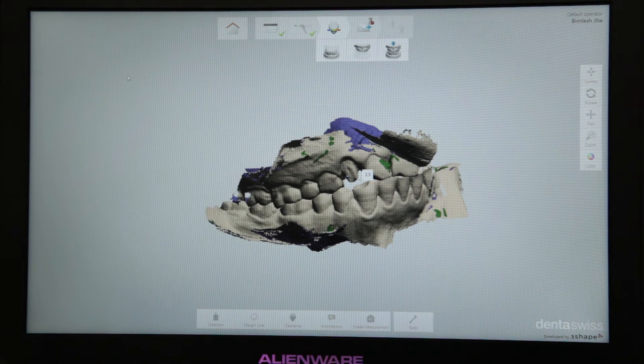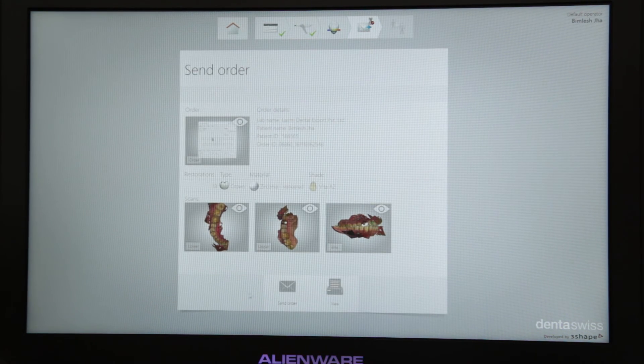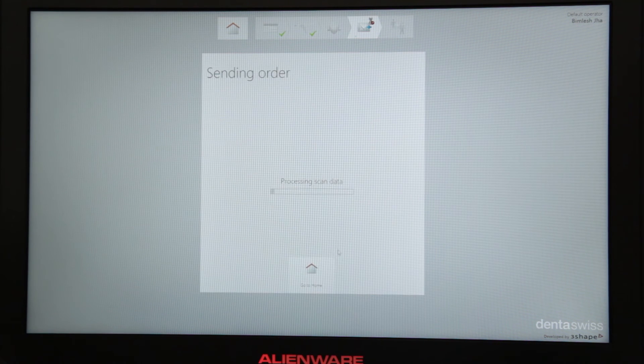Once the scan is done, you can just send the file to your lab via email. I'll just push this button right here and there you go — it's transferring all my files. This file is received in the lab and transferred to the CAD software where the prosthesis is designed, and then milled and delivered to your clinic.